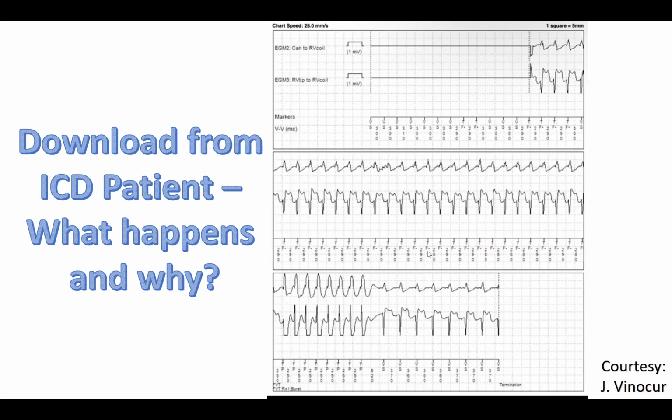Basically, what's happening here is the patient is going below. When defibrillators are programmed, usually one of the defaults is to have anti-tachycardia pacing on. So if a person's heart rate goes above a certain rate, let's say the criteria is a cycle length less than 300 milliseconds or a rate of 200, then while it's charging, the device will try to pace terminate the tachycardia.